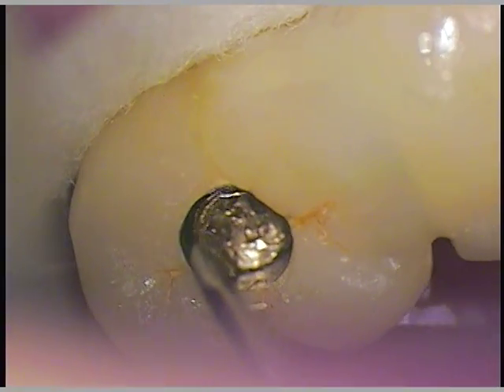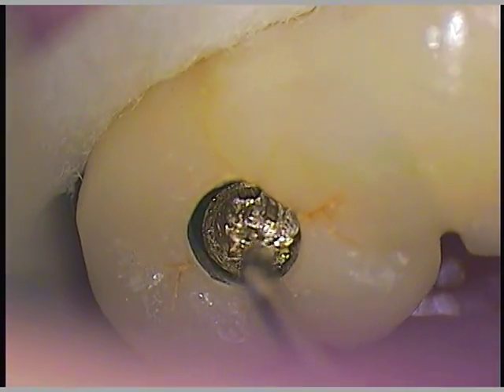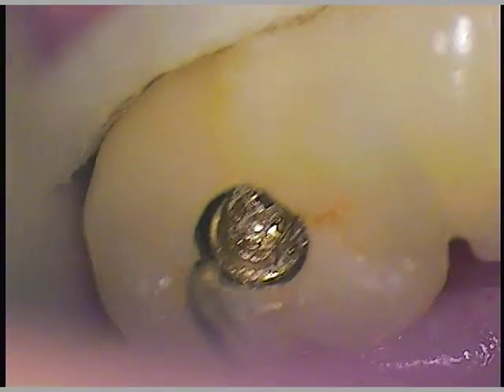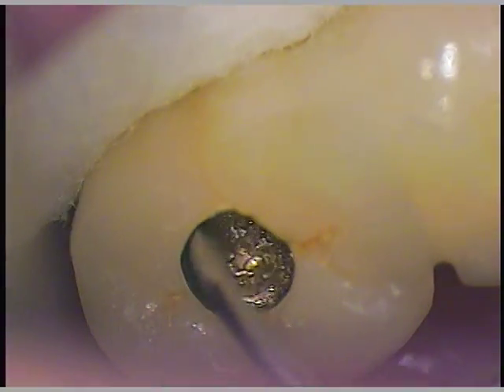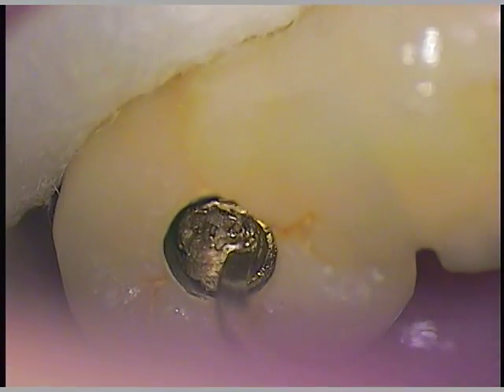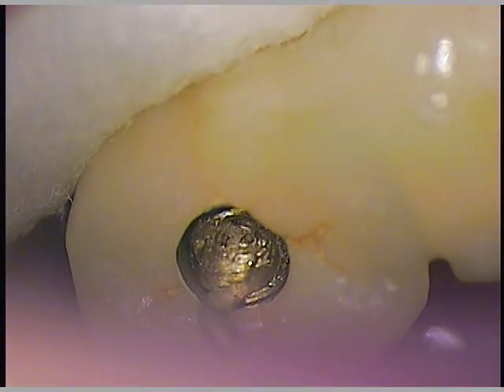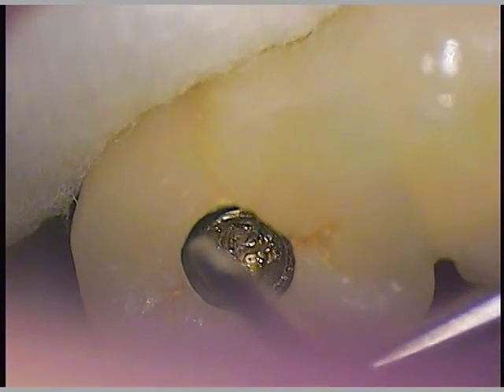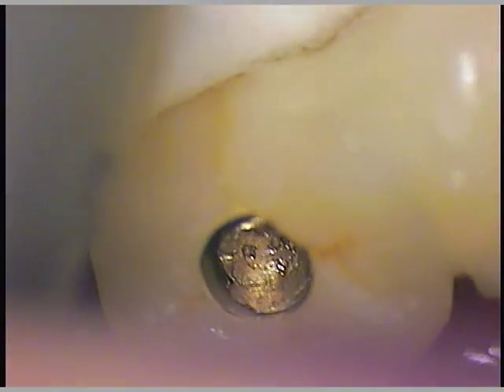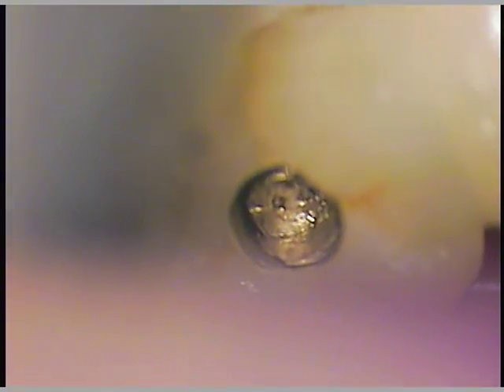I just take my time. We did what we were supposed to do. We can't always build the confidence because it's unknown — we don't know what's going on in there. There are percentages, but what are they? It's still a developmental thing. People are saying, what are the odds of success rates here? I don't think there's an answer. Don't be in a hurry when it happens. Try to get good magnification, number one. Join that tooth to the adjacent tooth — increase the stability.